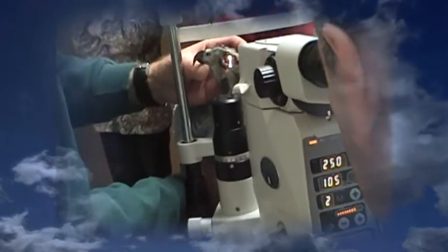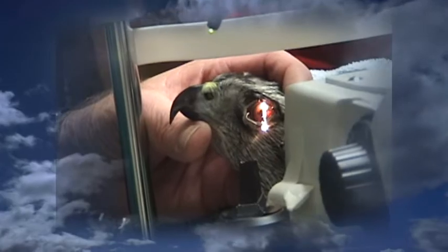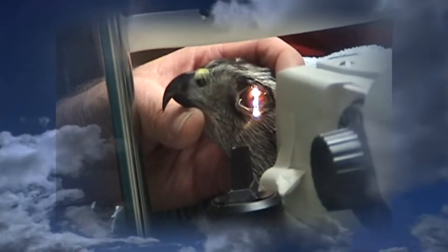Well, we were able to put a device in to hold apart the upper eyelid and lower eyelid. But as we're doing the laser, you could see the third membrane keep flicking back and forth the whole time we were working. So we had to shoot the laser in between those blinks. Well, the whole thing took about 15 to 20 minutes to get both eyes treated. And we could see, as we were treating it, we could see the film break up. And we could see that light could get back into the eye again.